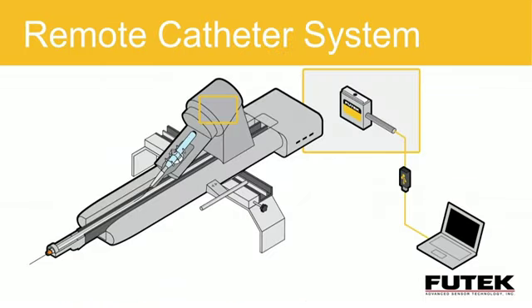Our last application takes us back to the medical world, where we're going to address the control of a catheter specifically used in electrophysiology, peripheral vascular, and cardiovascular applications.